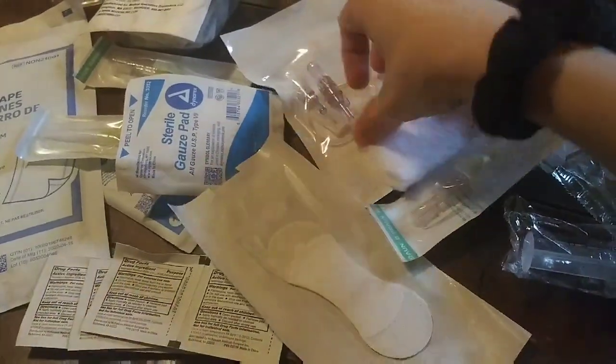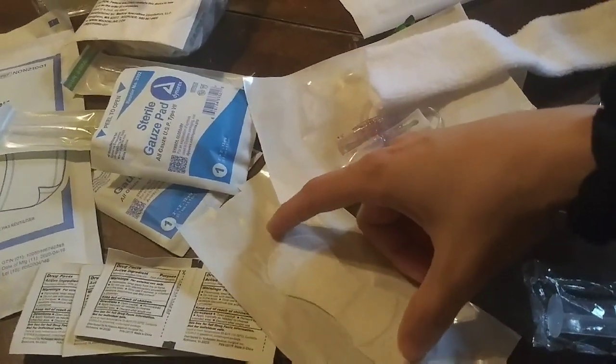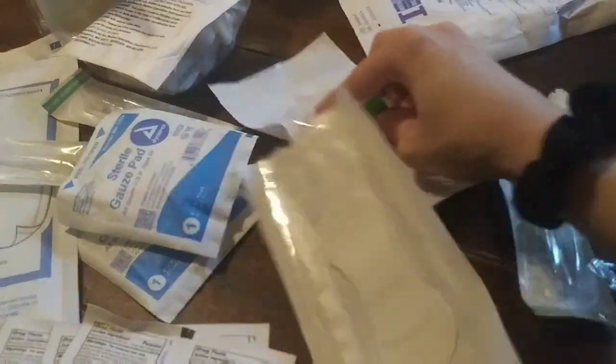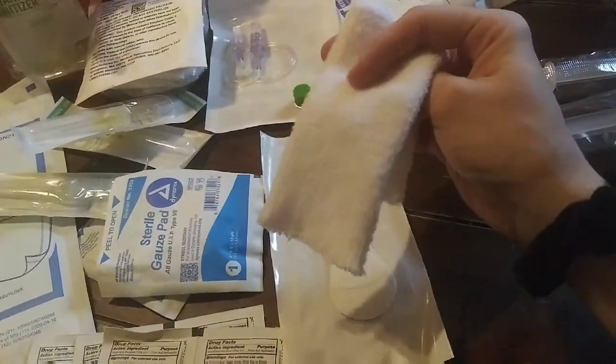Grip lock — once the needle is in place with the flow regulator on it, the flow regulator will be attached, and then this part of the flow regulator will be secured in this with this taped to my arm to keep it from moving. The Kuro here goes on the end of the extension to cap it off and keep it sealed when not in use. This is just a gauze cover that goes over all of that when it's in my arm when not in use.